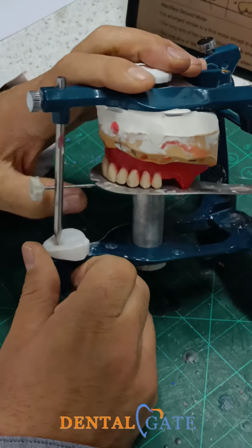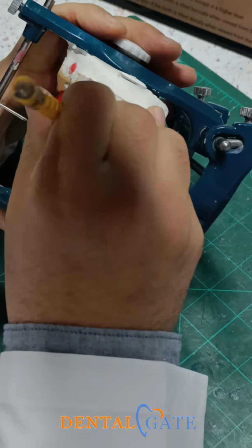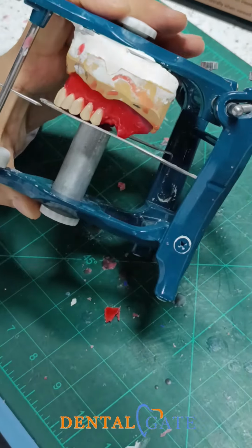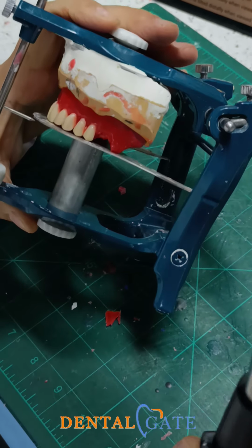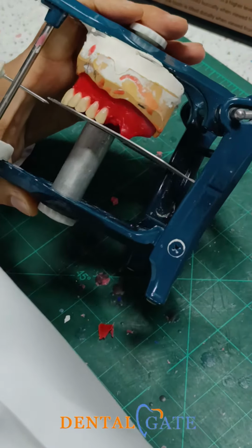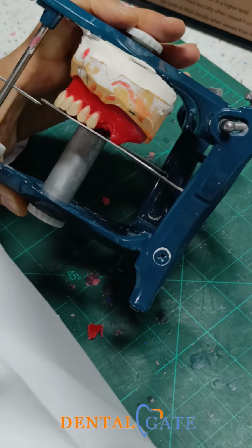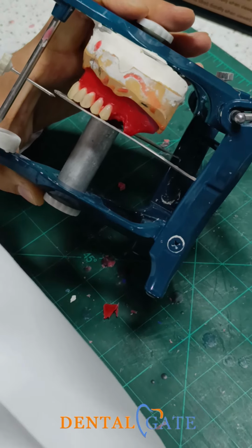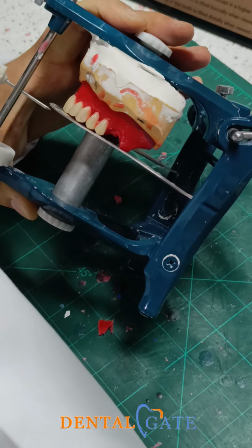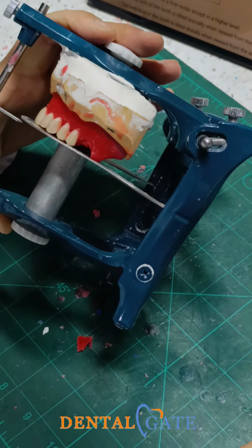Yalla, please pay attention. We have two teeth only. So, regarding the upper first molar, we pay attention to it because it is very essential to accomplish the normal occlusion within two curves.